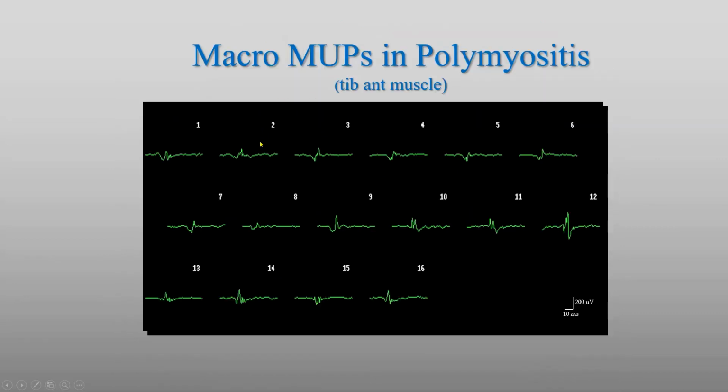Here are the small macro EMG signals in polymyositis, and you know that sometimes in polymyositis you get short high amplitude signals and you say, oh, is it a neuropathy also? And you misinterpret the recording. If you then do the macro EMG, these single high amplitudes come from just one fiber and they do not contribute to the macro signal.